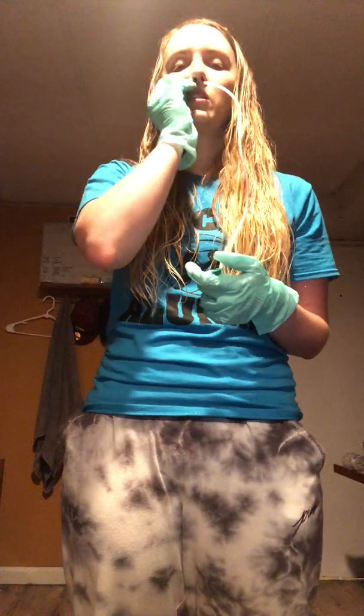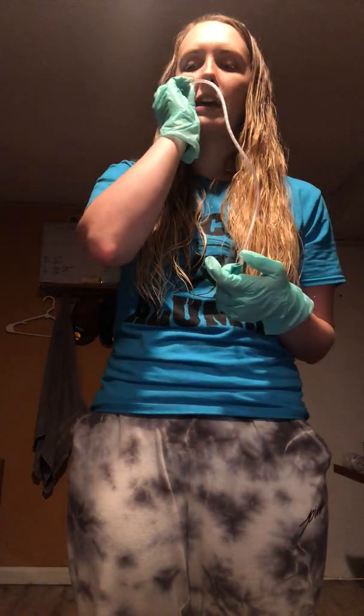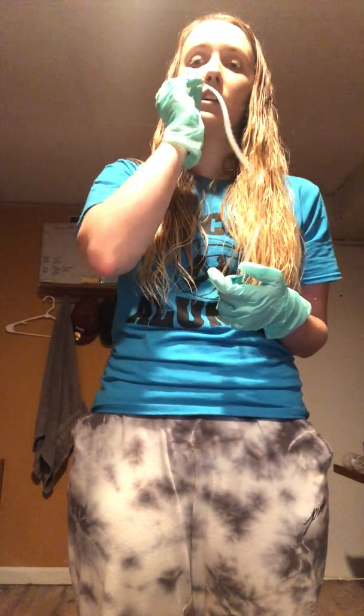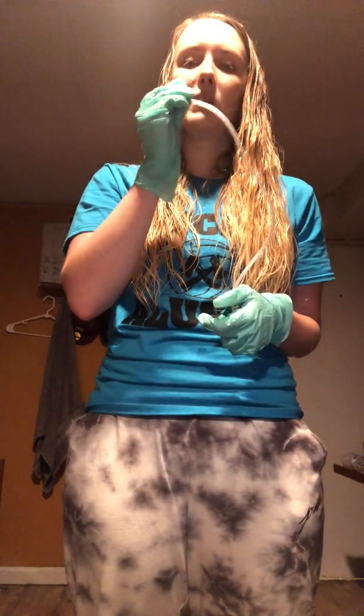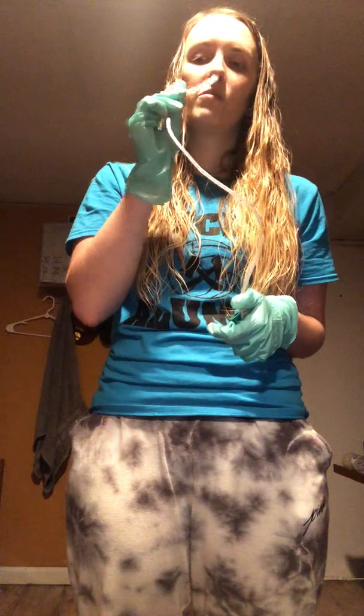we are going to go ahead and suction the patient. We're going to have them hyperextend their neck a little bit and hold their breath, and we're going to insert this quickly but gently. So you're going to insert, insert, insert, and you may get some resistance. If you do get some resistance, you do not want to force this, so you may need to switch to the other side of the nose.